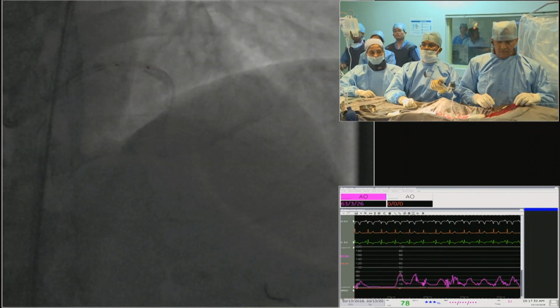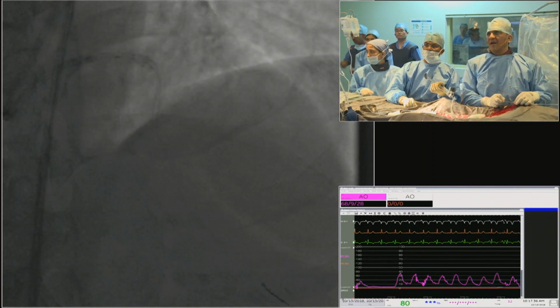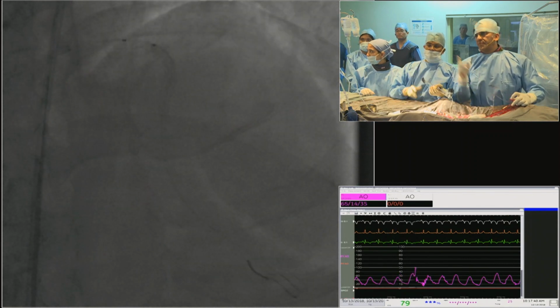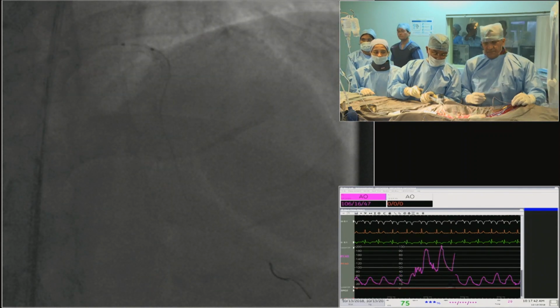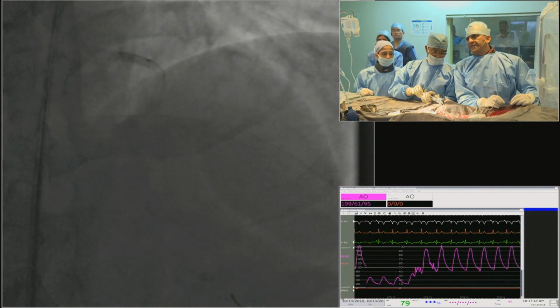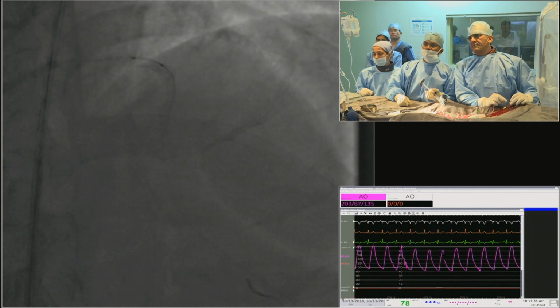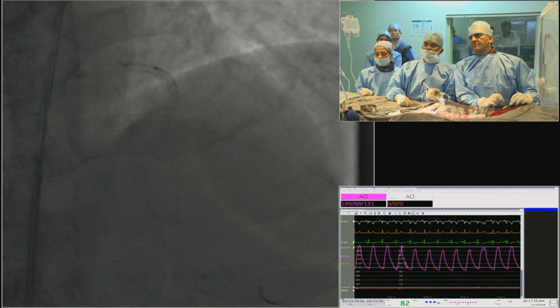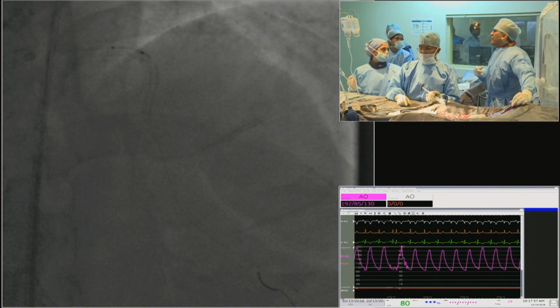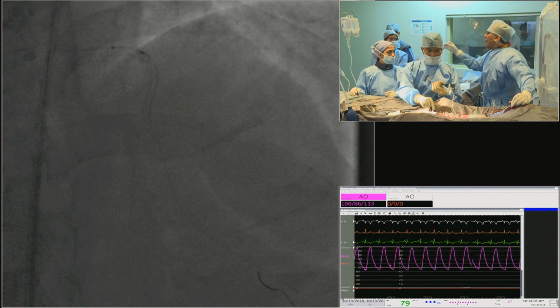What's your guide tip? Sir, that radial strength point, as you said, as you overexpand, sir mentioned that the radial strength is likely to increase. That really lends itself to logic, but I want to know whether this data has been shown in vitro. There is a Young's modulus of elasticity which would actually work, and the geometry change needs to be completely documented. What balloon was this? Has it been done in vitro? No, don't give me Apollo. Give me NC Trek or give me Euphora.